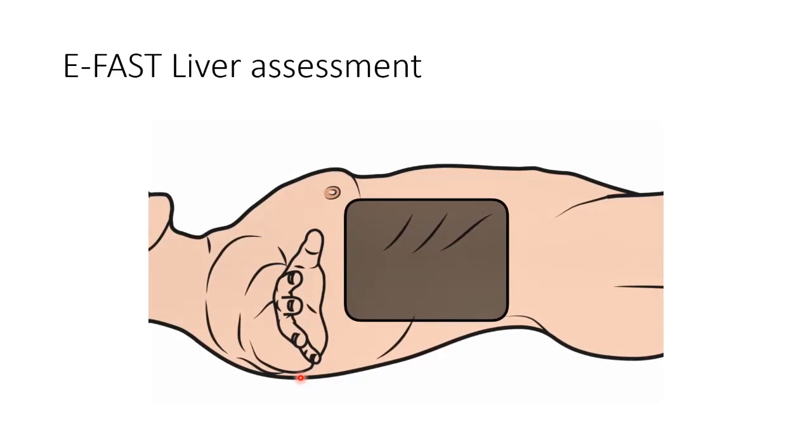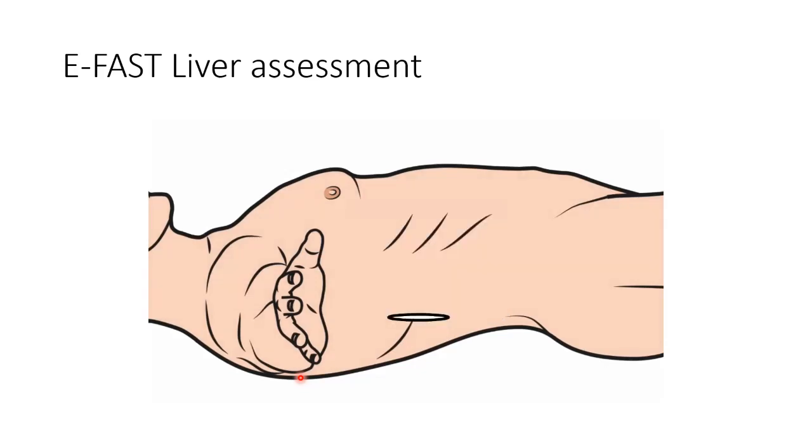Just like you would not look at a single CT scan, you would not look at a single image from the right upper quadrant. Instead, we're going to have to scan through the entire area to get an idea of what's going on in this three-dimensional structure based on our two-dimensional image. So we're going to start in the posterior area, and we're going to come anterior, and we're going to move throughout the interface, anterior and posterior, scanning through the entire three-dimensional area to get our information.